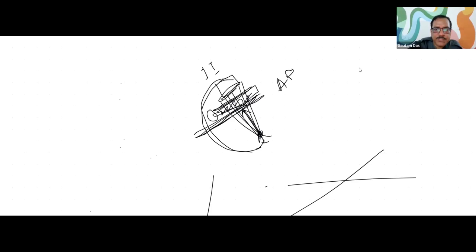So if the beam is coming like this, it is known as the AP view, and the AP view is always the preferred view. Never keep the tube above. Why? Because scattered radiation will be going all around. For radiation safety, you should always keep the X-ray tube below and the II above. The PA view, with the tube kept above, should not be done at any cost.